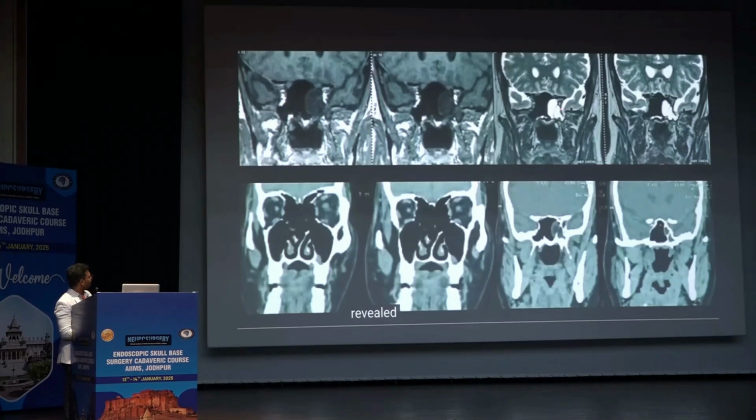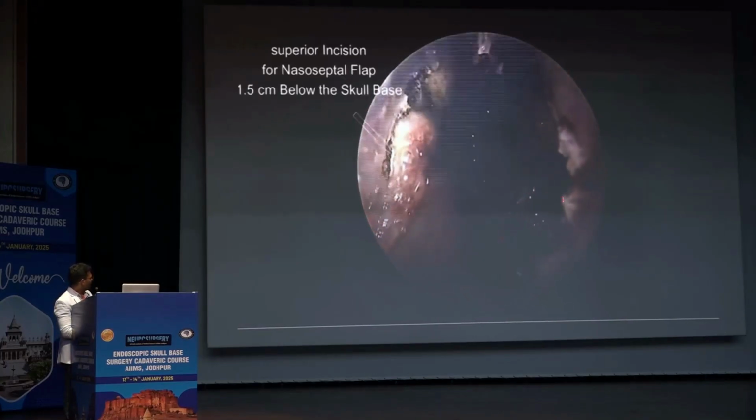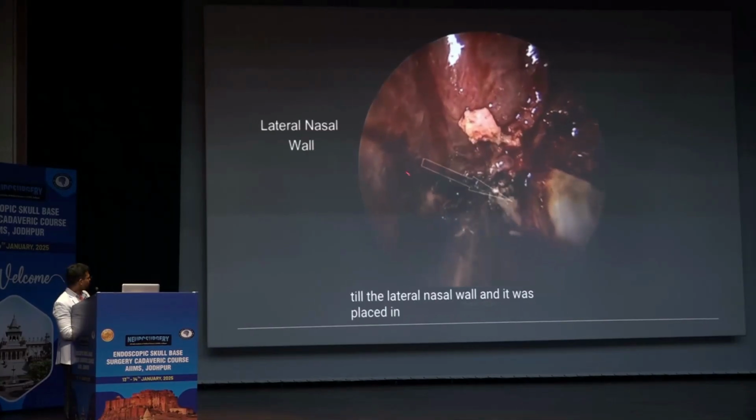So this is a case of type 3 lateral recess leak with less pneumatization. So I need to sacrifice the VDN in this case. So this is a type 3 leak. So you can see that this is a pterygopalatine fossa that was mobilized. And in this case, I use this very small Haddad.